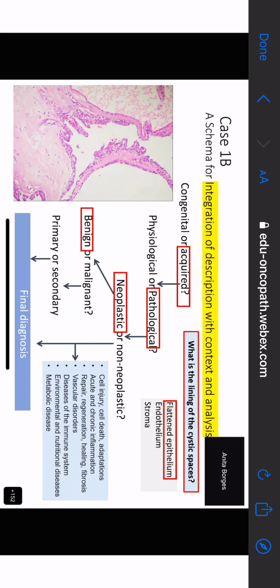So what are the cells in the body that are clear? What do they contain? Adipocytes, fat. Adipocytes, so it may contain fat, yes. Then? Glycogen. Glycogen, very good. Or? Mucin. Mucin, which is very thin mucin. And therefore, it may get washed out and you can see a clear cytoplasm. Now take a guess, Suveta.